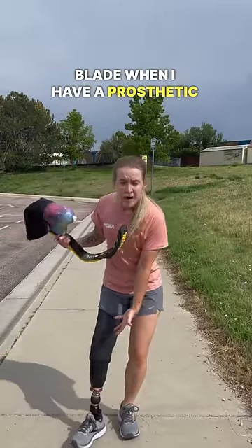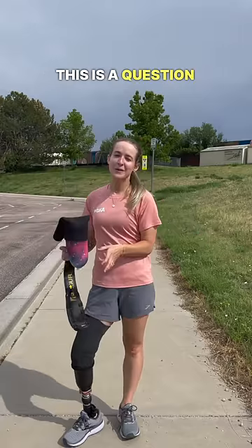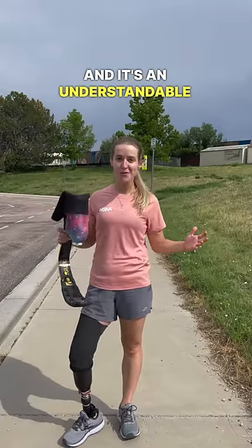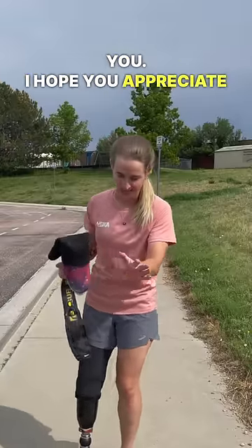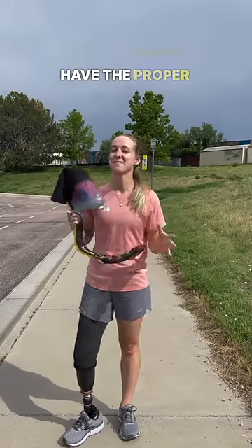Why would I need a running blade when I have a prosthetic that works perfectly well? This is a question I get a lot and it's an understandable one, so I'm going to demonstrate live. I'm sacrificing my body for you. I hope you appreciate why it is so necessary to have the proper equipment to run.